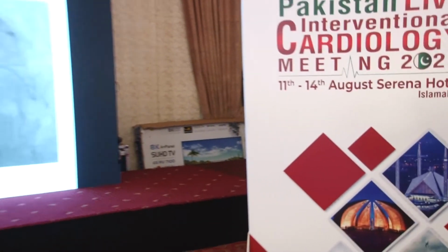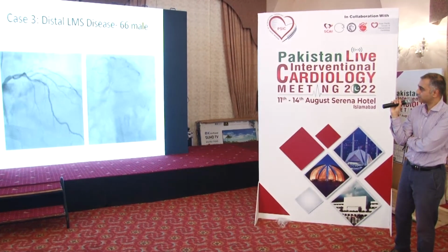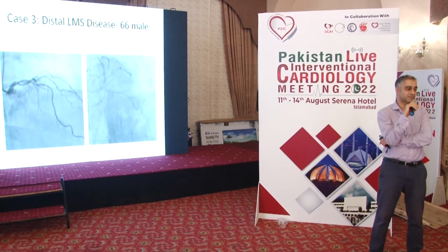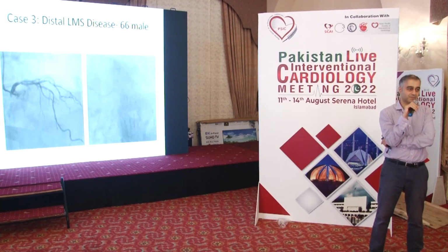Okay, so here's a left main stem. So 66-year-old with left main stem, and of course, left main stems are challenging because is this significant? Is it not significant? He's obviously ended up on the cath lab table because he's been having some chest pain. So how can you make that assessment?